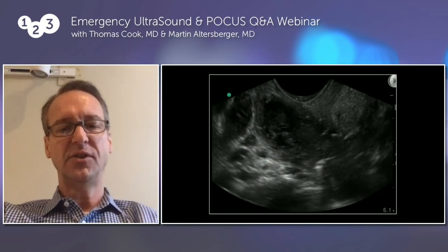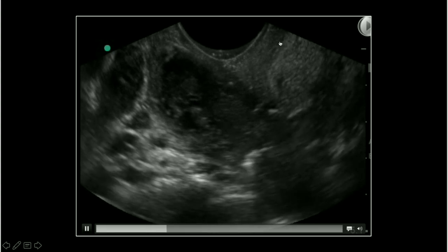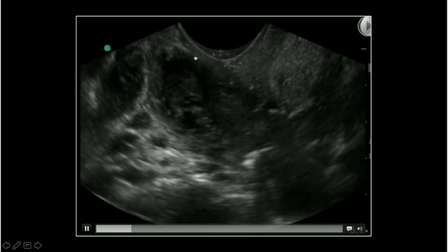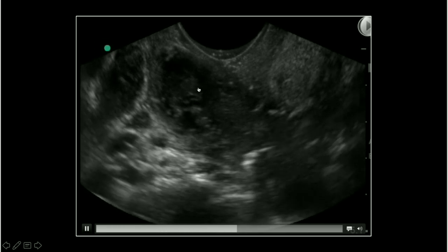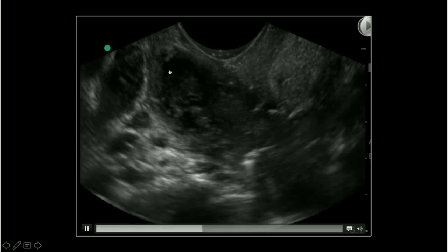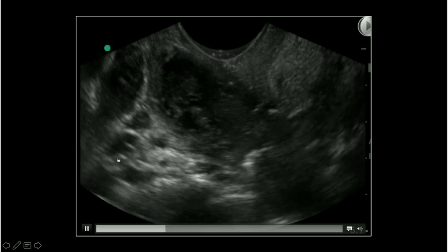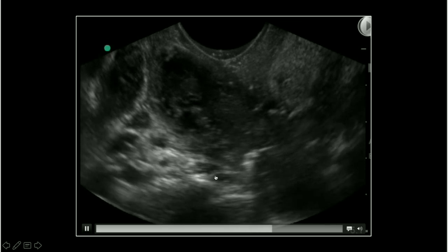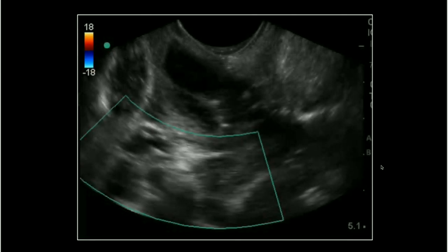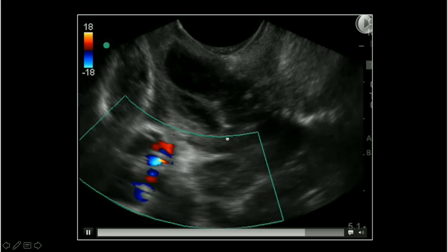So this is actually what you're trying to see. In the area just beneath the transducer, there's a round area right where your cursor is now. That whole area, that's abscess, okay? And that is sort of a heterogeneous picture when you place it right there. But if you look right below that abscess, there's something pulsating down in the bottom part of the screen. That is what you don't want to put your needle into. That would be really, really bad. That's the carotid artery. And if you advance the slide, you'll see that we have color flow on that, and you can say, okay, I definitely don't want to put my needle in there.